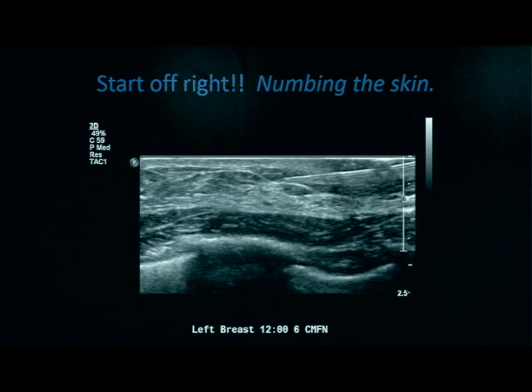Here we see a basic ultrasound with the needle going into the skin. Take a look at the hyperechoic needle. We see the entire needle in this image, and you never want to lose track of your needle — especially not the needle tip — so that you know where you are relative to the mass and chest wall. The hypoechoic material here is muscle in the chest wall, and this is a rib. Also note the artifact: several hyperechoic lines stemming down from the needle — this is reverberation artifact.